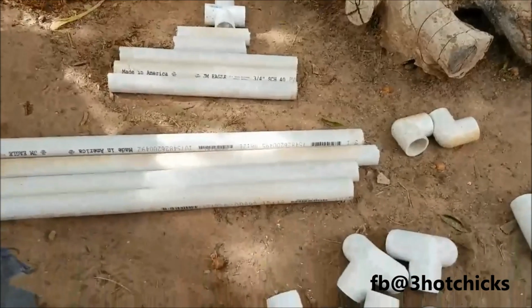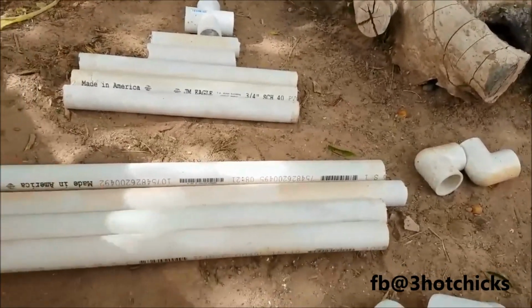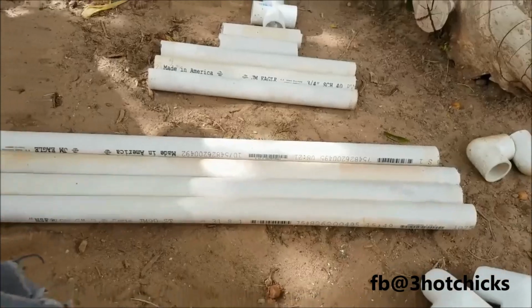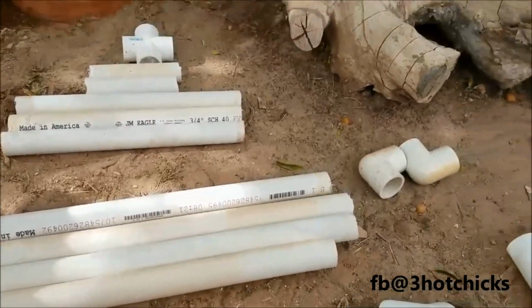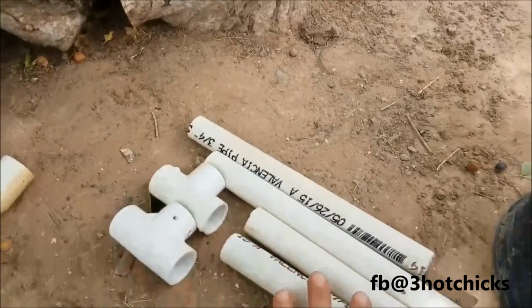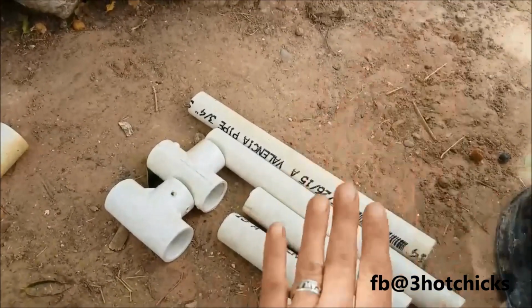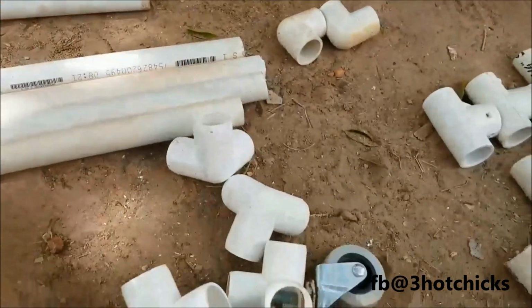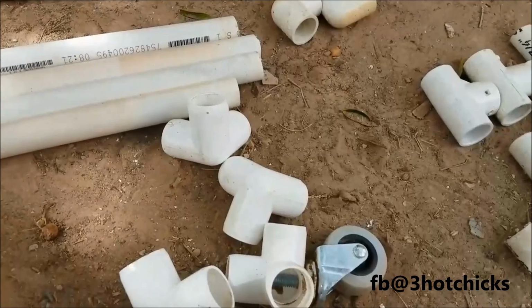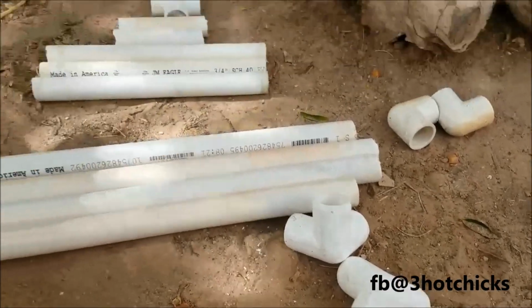Got all my parts taken apart. So we've got 4 pieces. That's going to be the length of the wheelchair. That's these 4 here. And then we have these pieces are going to be the height. And then these ones are going to be the width. And then we got our fittings. So I'm going to attempt to put it all back together.